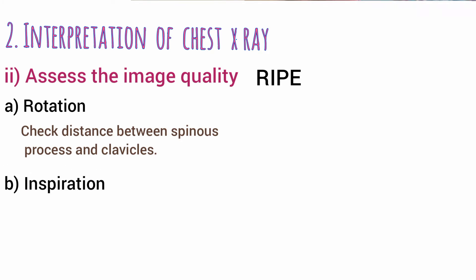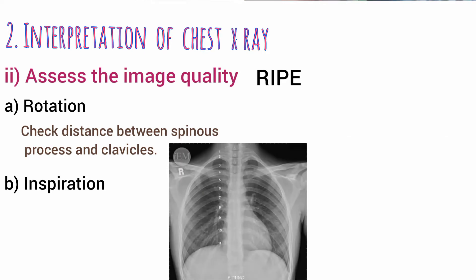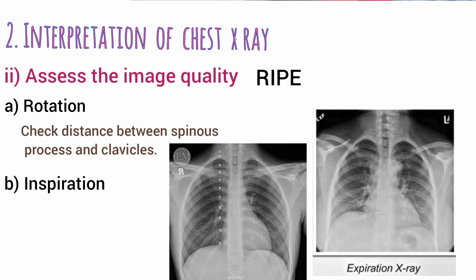Next, assess inspiration. While taking a chest x-ray, the radiographer asks the patient to breathe in and hold their breath, to examine the patient on full inspiration for a better overall image. To consider a chest x-ray adequate in terms of inspiration, you should be able to see 8 to 10 posterior ribs.